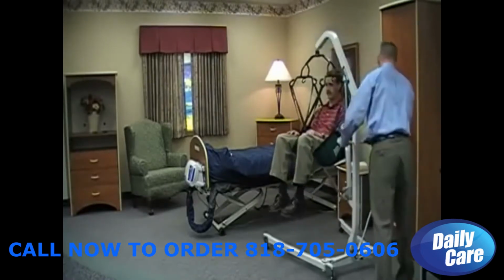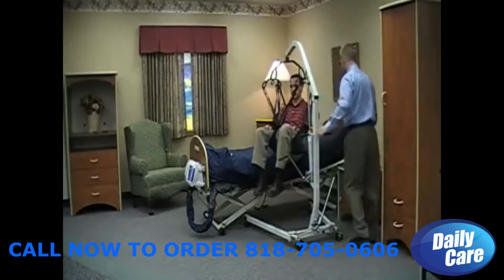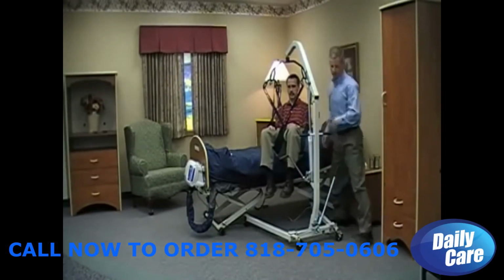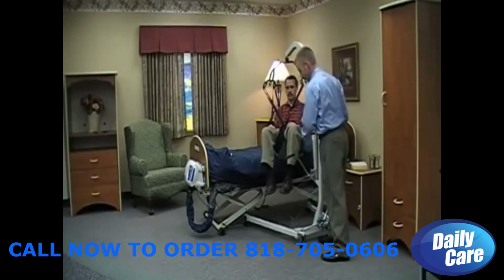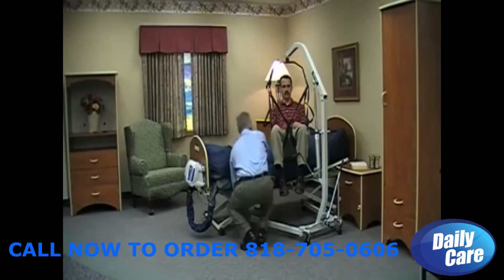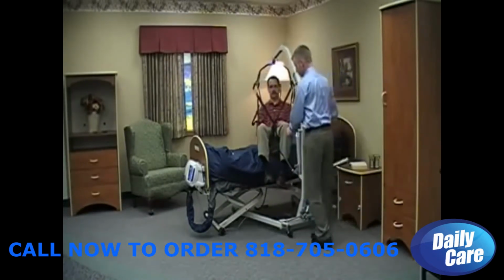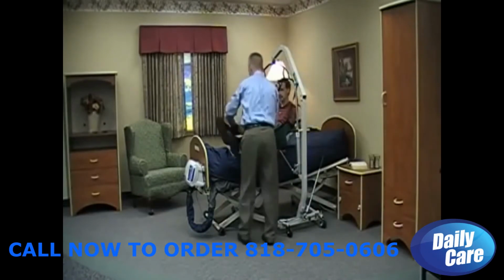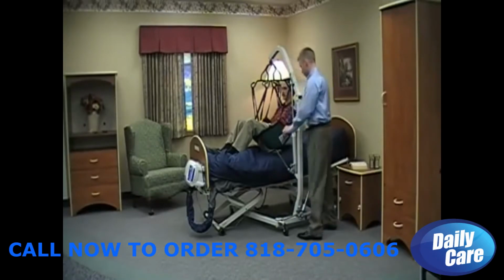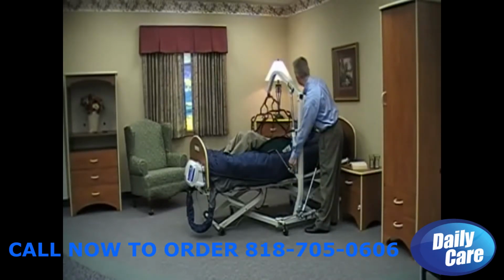Now I've kept the legs of the base open to allow for a safer transfer. We want to ensure that we clear any wires or anything that might be underneath the bed surface, and go ahead and position them appropriately. And after having ensured that our resident's in the appropriate place, we can go ahead and turn that dial and lower them.